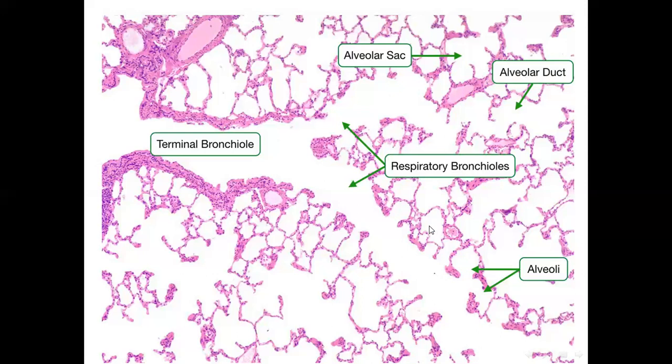بالنسبة للcomposition مالت respiratory bronchiole, it's similar in structure to the terminal bronchiole and their epithelium. It's simple cuboidal epithelium rich in club cells and some ciliated cells. But this epithelium is broken up by the presence of thin-walled pouch-like structures known as alveoli.